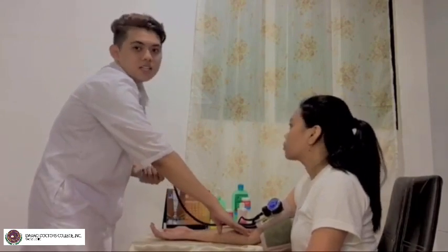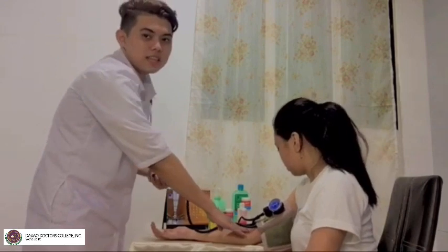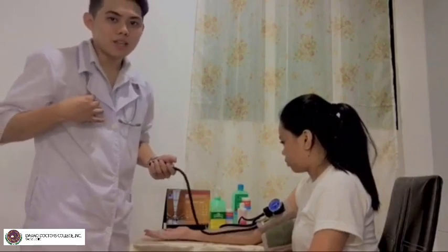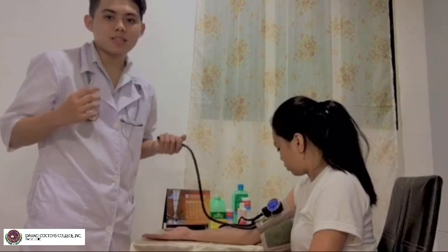Okay. So now we need to position the stethoscope appropriately. Cleanse the earpiece with an antiseptic wipe and insert the ear attachments of the stethoscope in the ears so that they feel slightly forward.